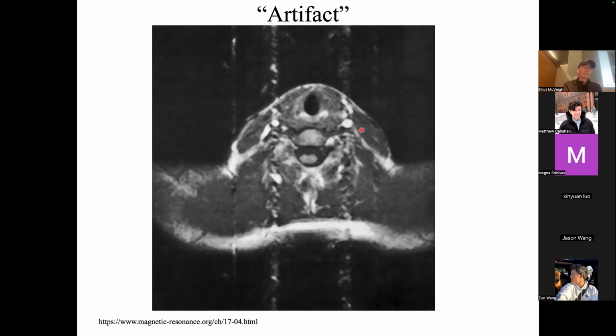If you put a stethoscope on your neck and you listen, you can hear the blood swooshing by, like whoosh, whoosh, whoosh. And in MR, if you don't account for the fact that the blood signal is coming through your plane of imaging, and if you don't gate to the heart rate, it's coming through at kind of random points in your acquisition, it really screws up your phase encoding. Like, where is the vertical value of this thing? And you can see it gets spread out over all this stuff. This is called artifact. So it's signal, it's not noise, it's not random signal, it's caused by a physical process, but it's just getting in the way of making a good picture.